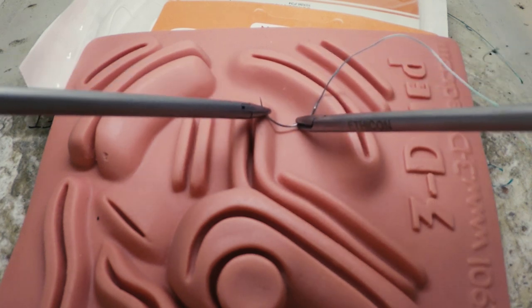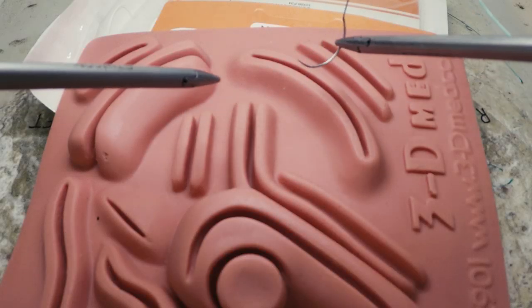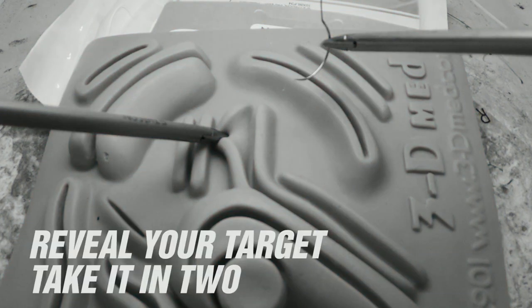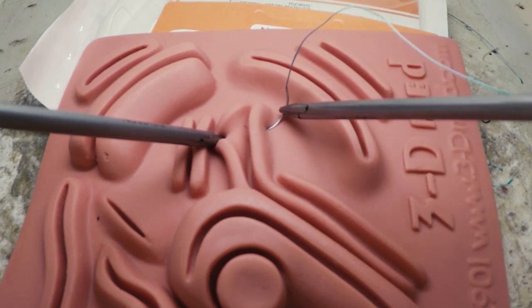Grasp the needle approximately one third of the way from the swage for maximum tissue penetration without undue torque on the needle. Next, distract the tissue to give yourself a clear visual of where you're coming out in the tissue. Enter at a right angle, then supinate to follow the curve of the needle just like you would outside the body.